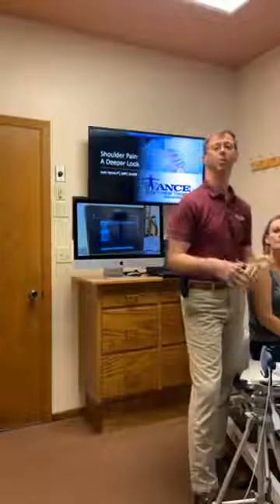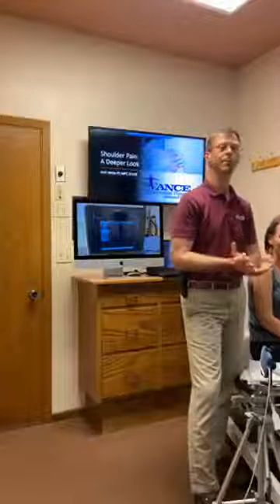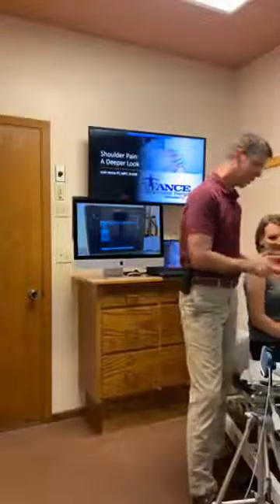We're going to be taking a deeper look using a diagnostic musculoskeletal ultrasound tool. We're going to show some normal and some abnormal pathological structures, and then talk a little bit about what we can do to help those structures to help people get better, because that's what we do, help people get better.